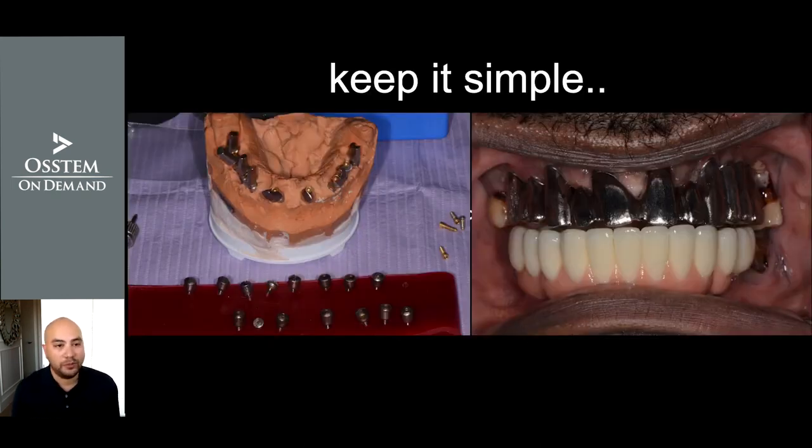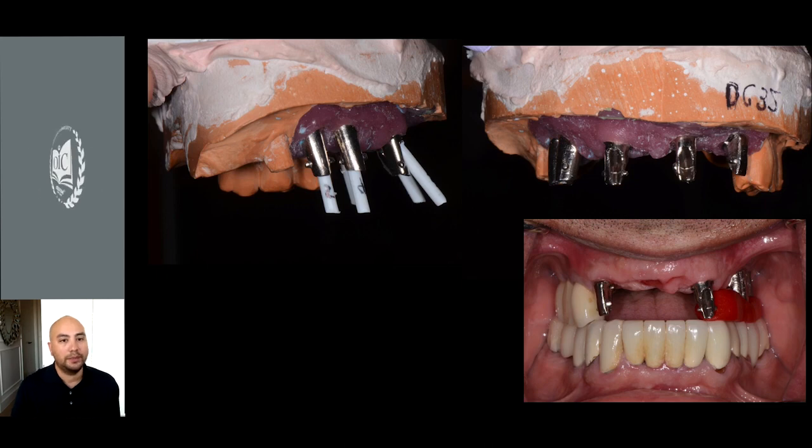Without using the multi-unit abutments, things can be very, very complex, like in this case. The access hole could end up buccally.